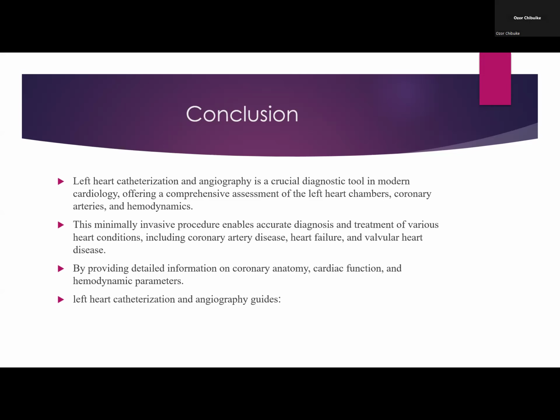By way of conclusion, left heart catheterization angiography is a crucial diagnostic tool in modern cardiology, offering a comprehensive assessment of the left heart chambers, coronary arteries, and direct measurement of hemodynamics. It enables accurate diagnosis and treatment of various cardiac conditions, including coronary artery disease, heart failure, and valvular heart disease.